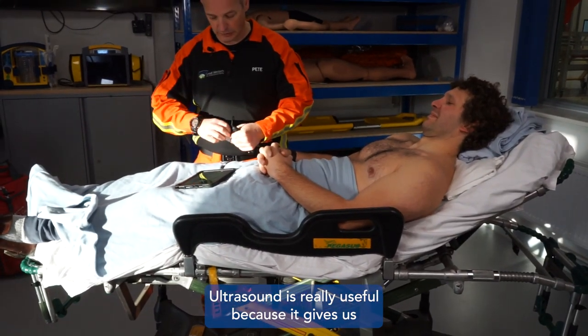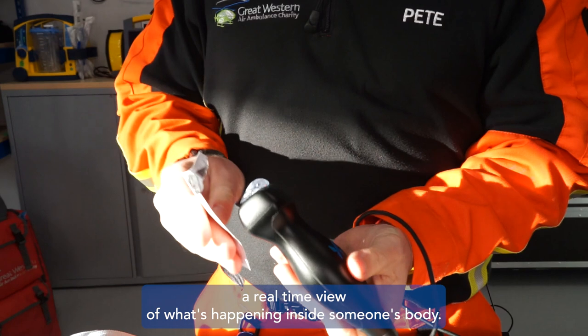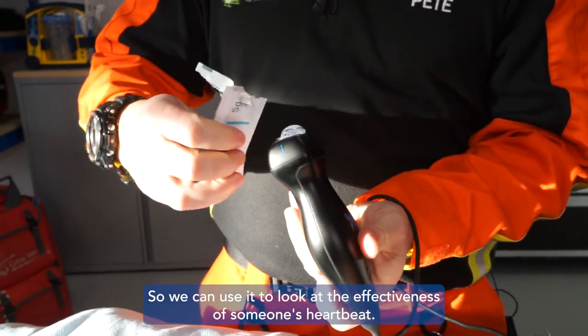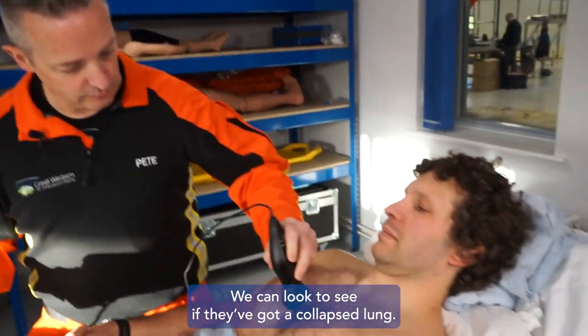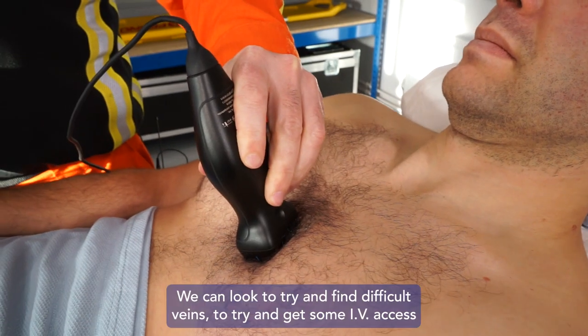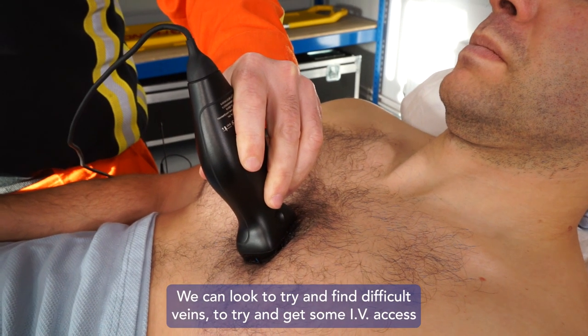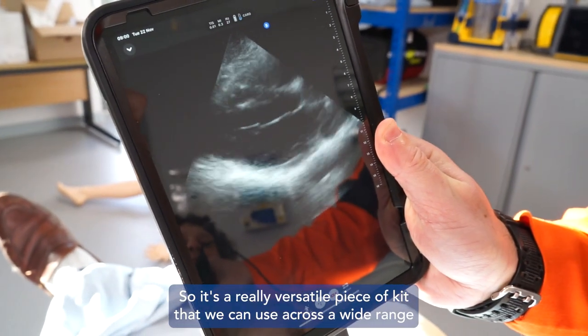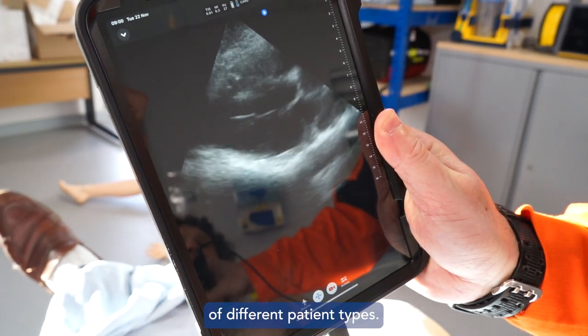Ultrasound is really useful because it gives us a real-time view of what's happening inside someone's body. We can use it to look at the effectiveness of someone's heartbeat, we can look to see if they've got a collapsed lung, and we can look to try and find difficult veins to get some IV access. So it's a really versatile piece of kit that we can use across a wide range of different patient types.